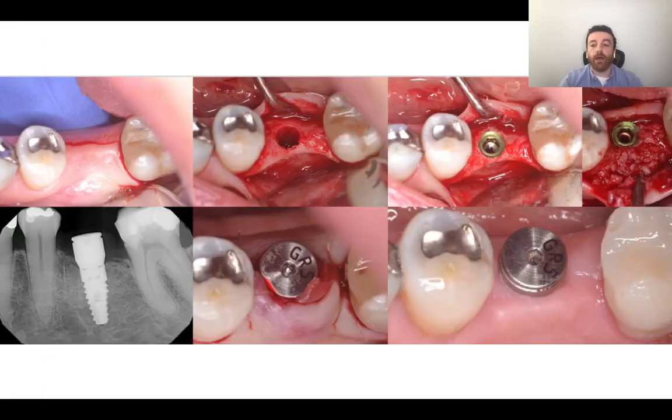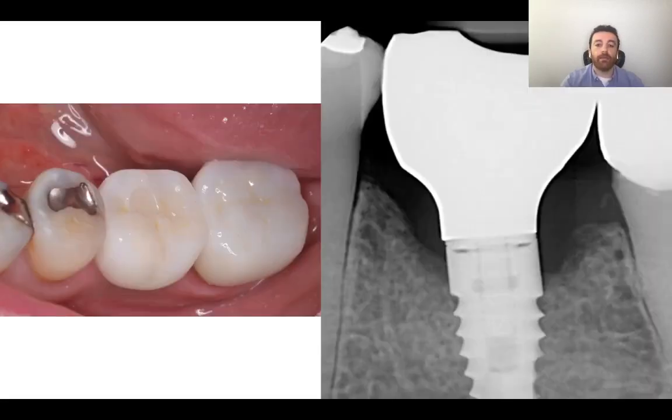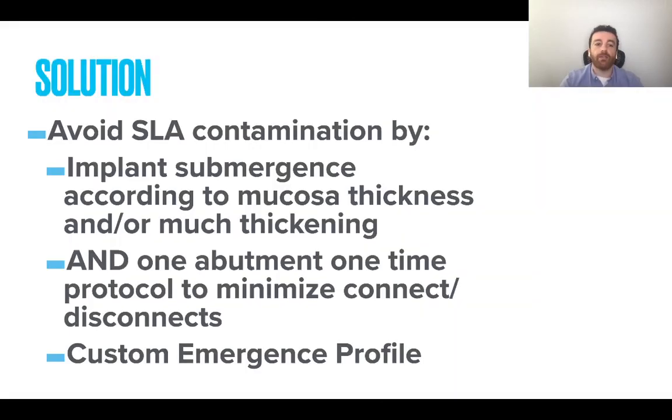So you can see here again, if we're not paying attention to our tissue thickness, you place your implant simply at the crestal level, even with grafting of the area. When you come and place your healing abutment or you follow up over that year period, you do end up with that remodeling despite placing our implant in a very nice position originally. But the vertical position of the implant needed to actually be subcrestal. Okay? So compare it to this case here on the left where the implant's placed subcrestal and restored, you do not get that bone loss and potential exposure of our SLA surface.